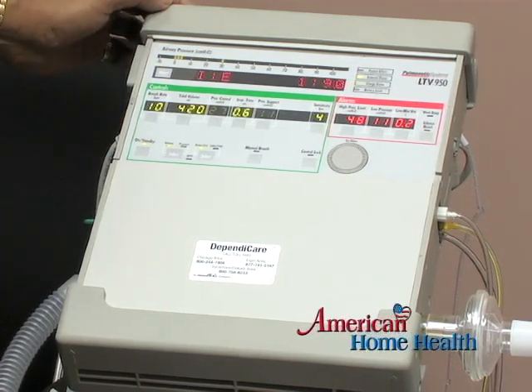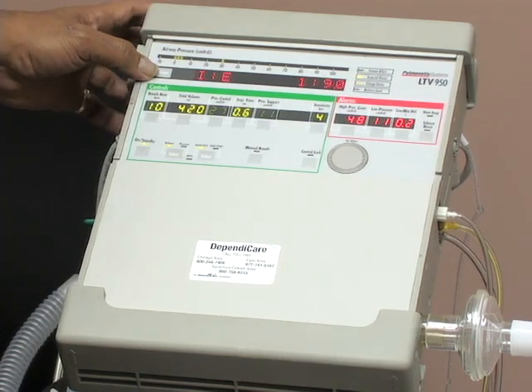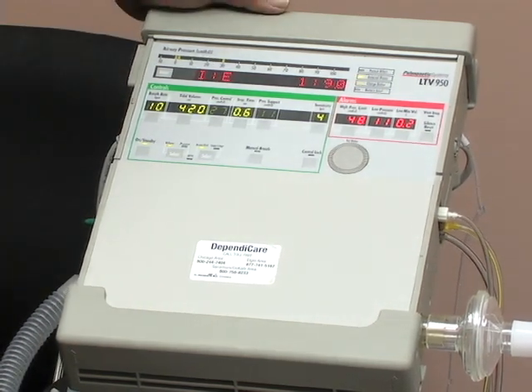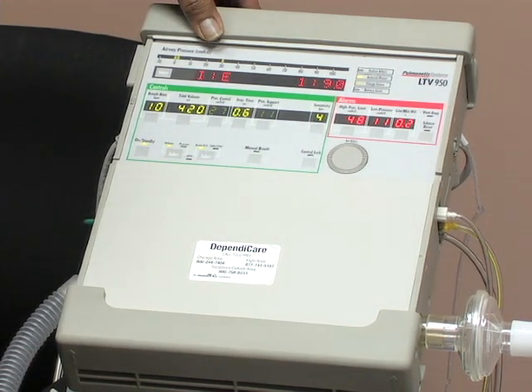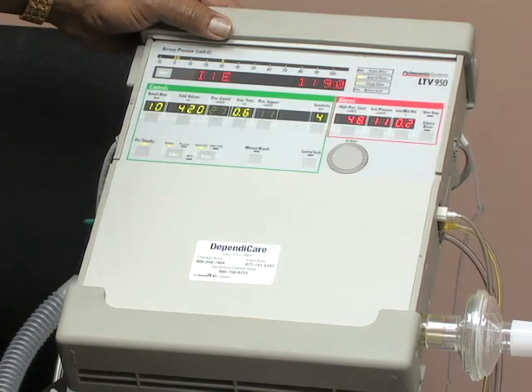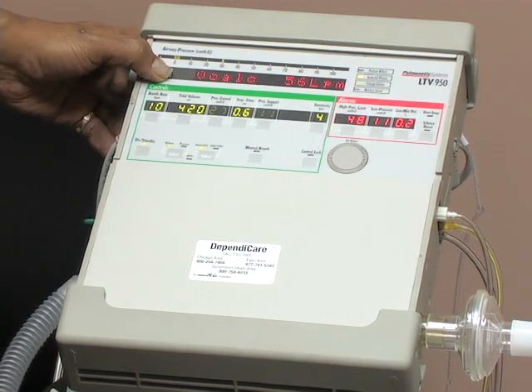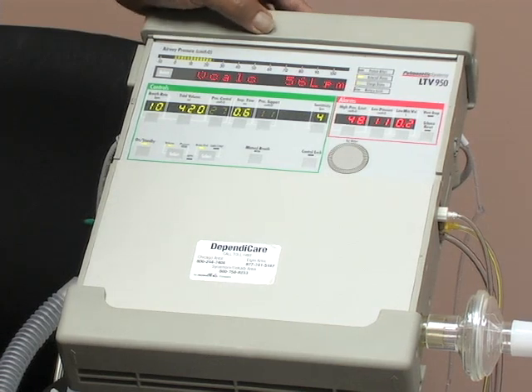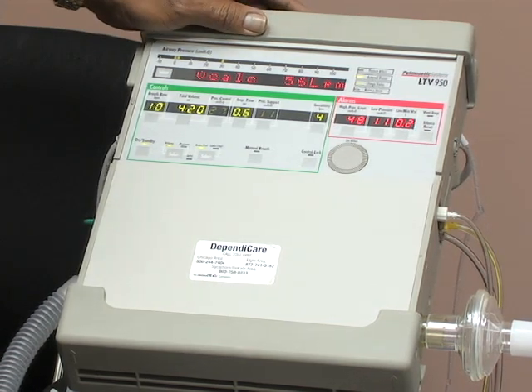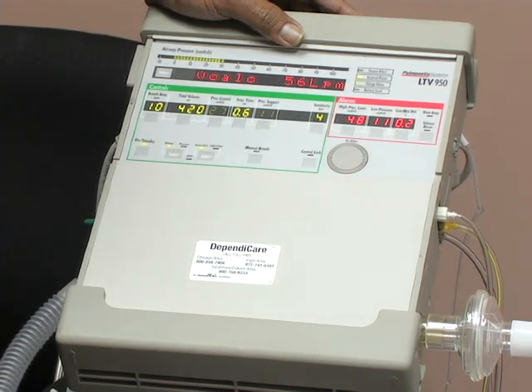The IE, or inspiratory expiratory ratio. This is also a measurement that shows the length of time that it takes for expiration versus the length of time that it takes for inspiration. Your V-calc. The V-calc is something that's also much more useful to your respiratory therapist. This is basically your client's peak flow on each breath.